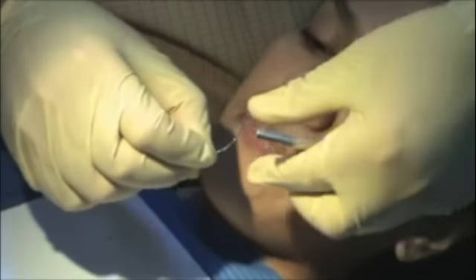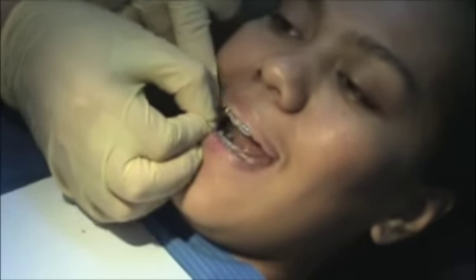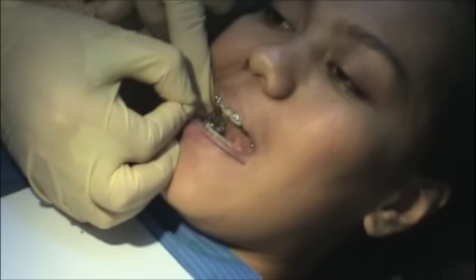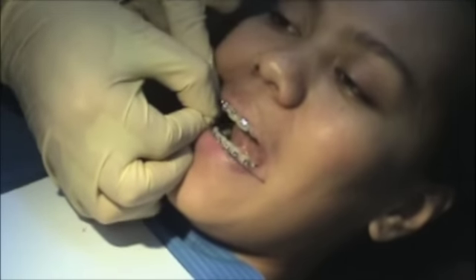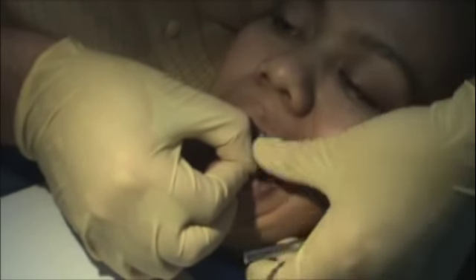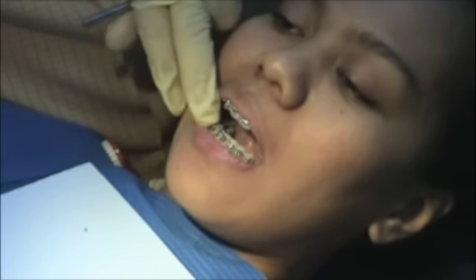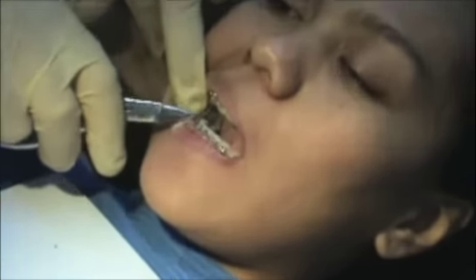The person that bends the wire should always place the wire back in. So I realize we have to reposition the bracket, but I want to make sure it doesn't go in upside down. So now we're going to push in the wire on the other side.